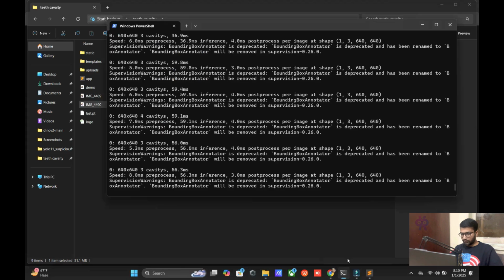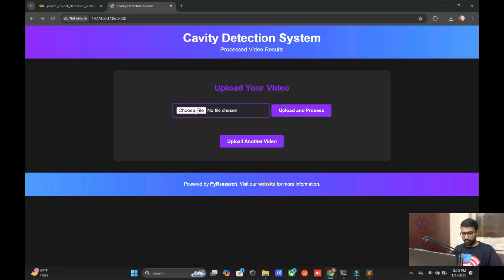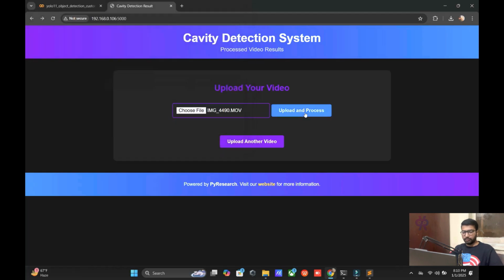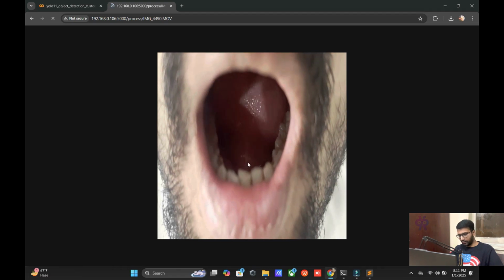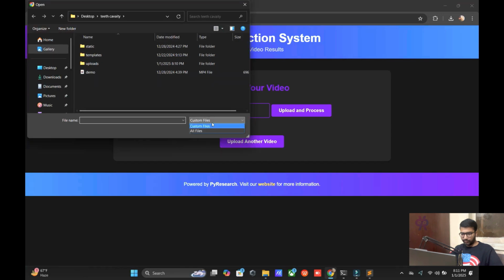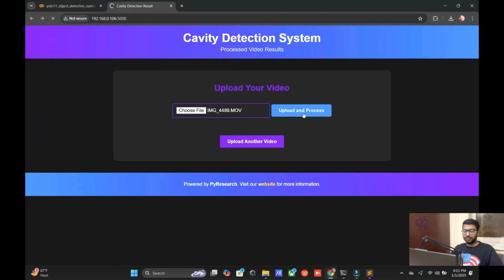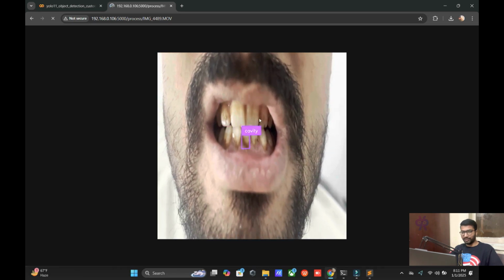Okay, so here, cavity. And let me try another video. I have two videos, but this one has a small mouth and will cause issues. Okay, but let me check it out. It's working, not working. Okay, two videos are enough for the demo. So let me open the first video. The second video, with the small mouth, is not working because we could not shoot the video properly.